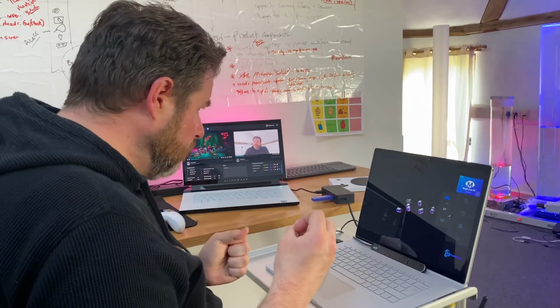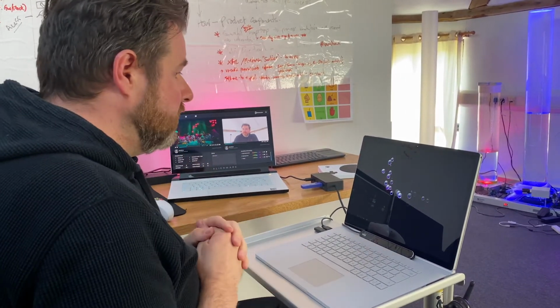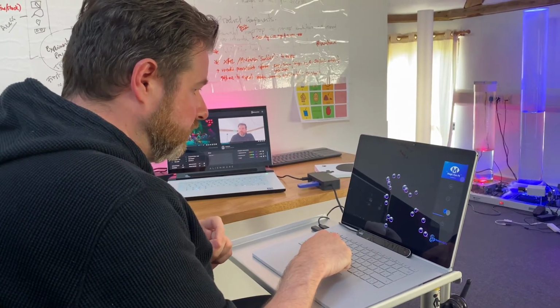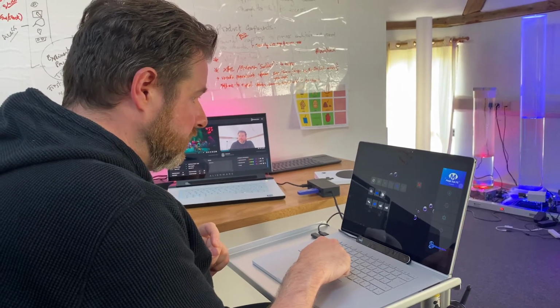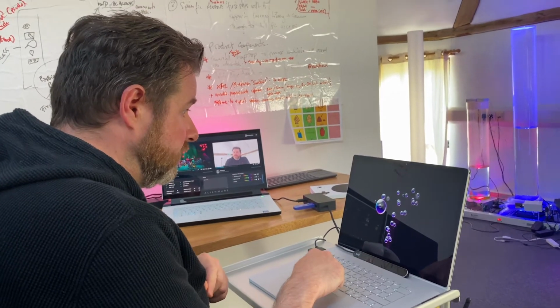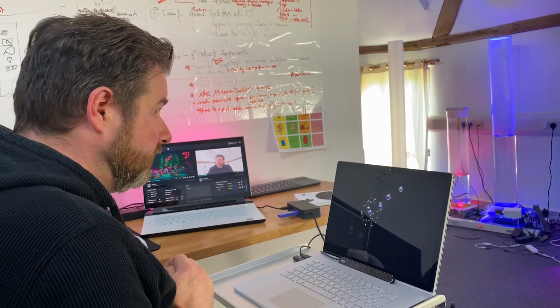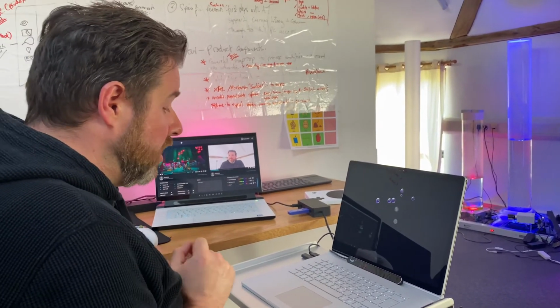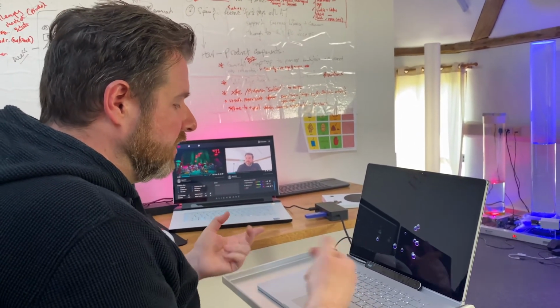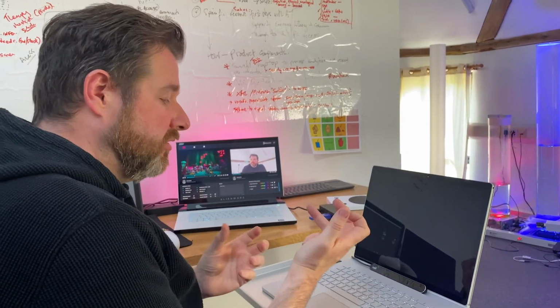So what I'll do here, if I say close menu, I can bring in an object into the scene. Let me just double check I've turned off eyes and switch and gone back purely to dwell. You can see now, if I look at this object, that's a 3.7 second dwell time requirement. In the context of using long dwell times, what we're more looking at is being able to actually discriminate or focus on a specific object for a certain period of time.